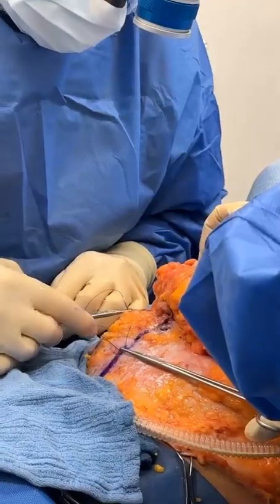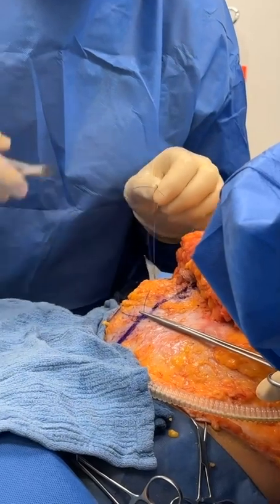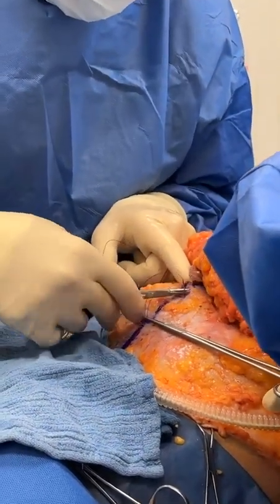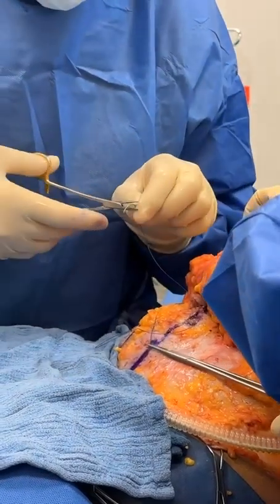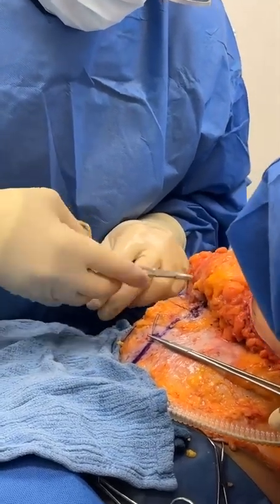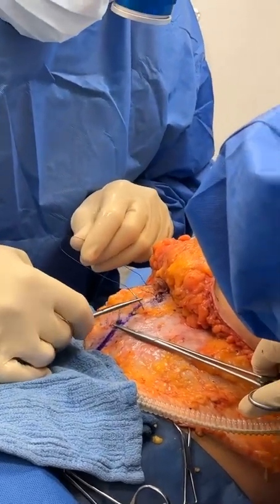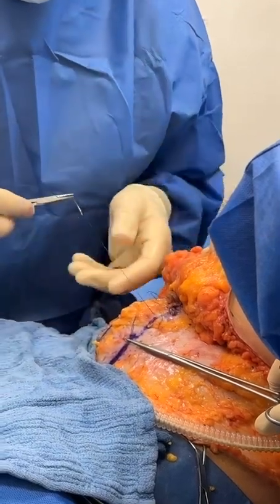Thank you. Elena, do you see that bulge over here? Yes. That is intra-abdominal fat. Same fat like this, but inside. That's where the intestines are. That's fat that cannot be removed with liposuction or a tummy tuck because it's inside. So what we can do is just push it in. She's still going to have that fat, but we're going to push it in.